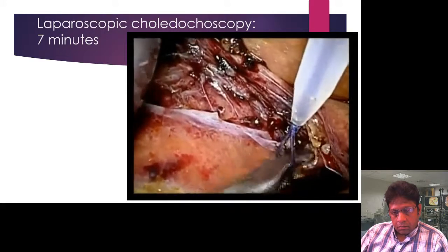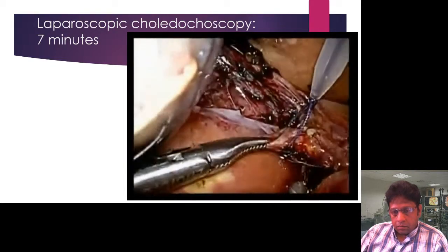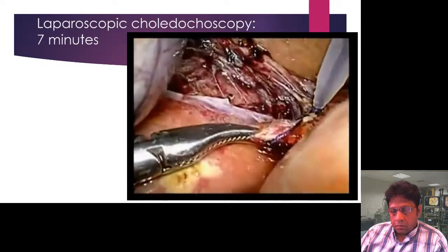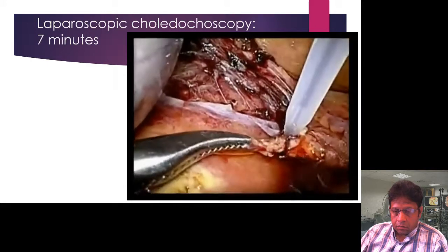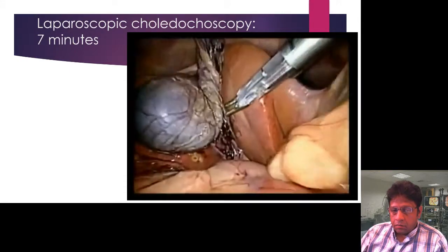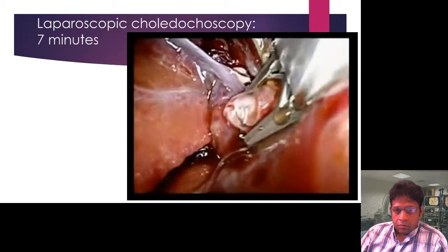The cystic duct is then ligated using an endoloop. This short cystic duct remnant required precise placement of the endoloop. To ensure that the loop did not become dislodged, a hemoclip was placed as additional insurance.